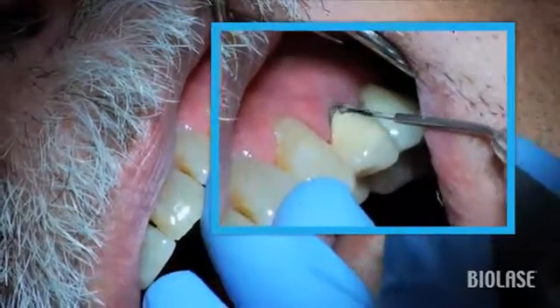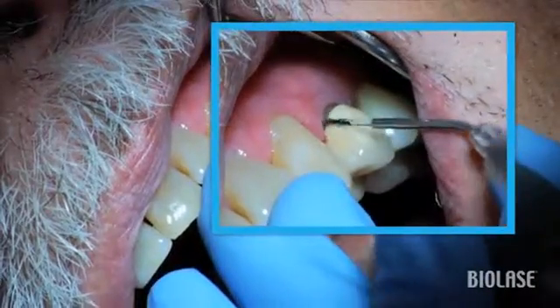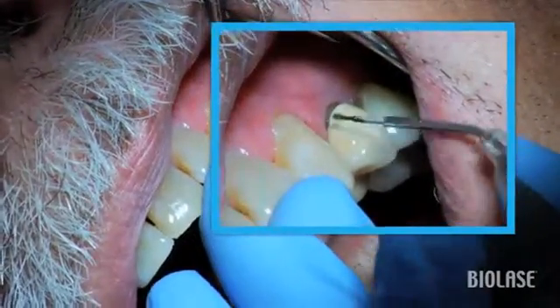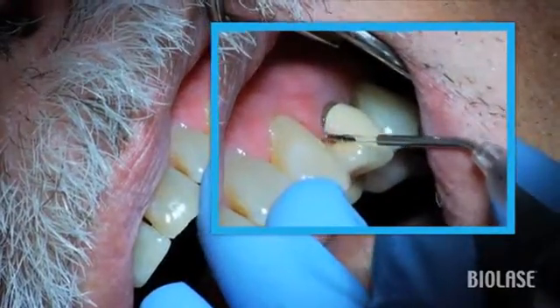She is utilizing the zigzag technique on the mesial and distal aspects of this tooth by using the tip like a probe in a zigzag pattern. The circular method is being used on the buccal aspects.